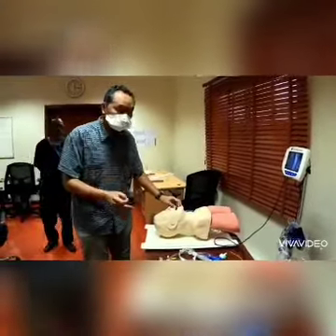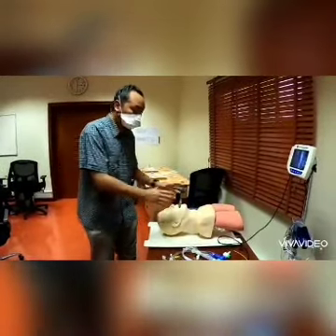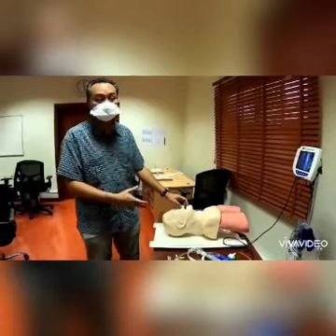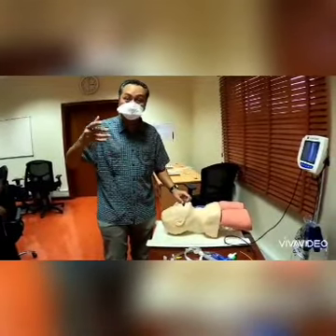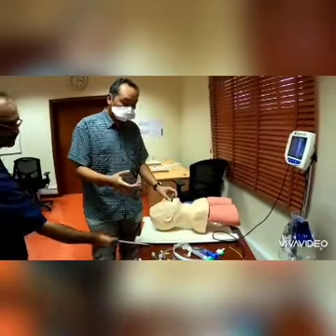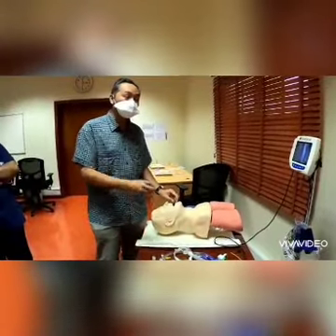Just a quick reminder, most of these patients will be very hypoxic, which means the saturation will be very low. So for many of them, it doesn't matter how much you pre-oxygenate them, you will have to start the intubation process or the RSI process while they are desaturating. So it's very difficult to use saturation as a guide, because your saturation will drop almost immediately when you give your RSI drug.